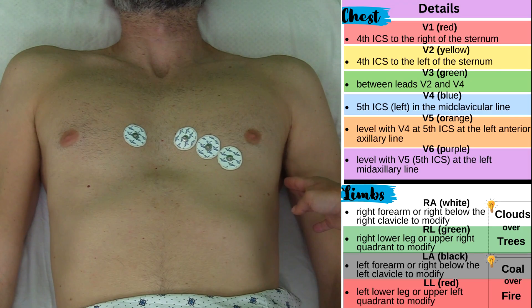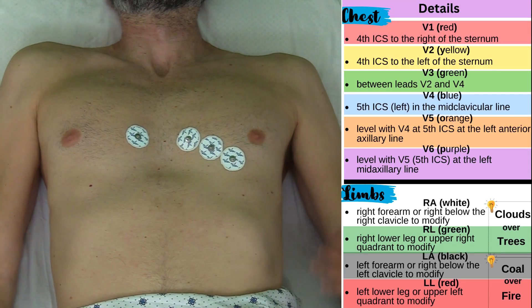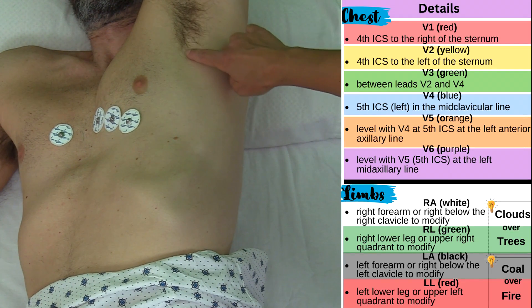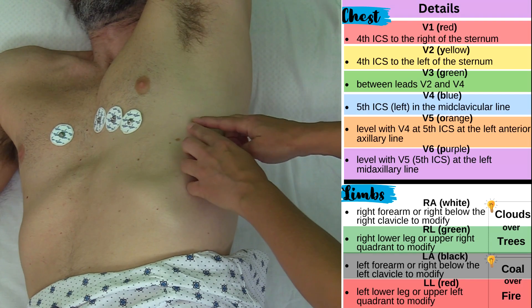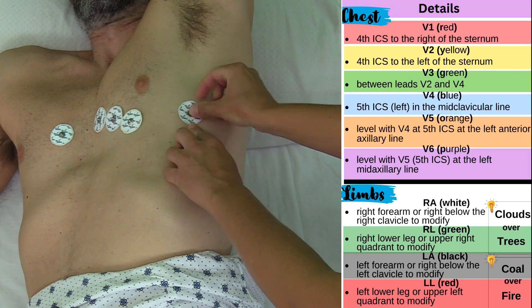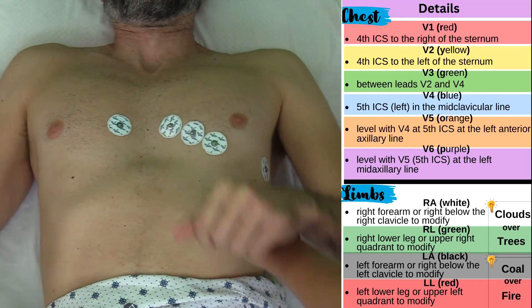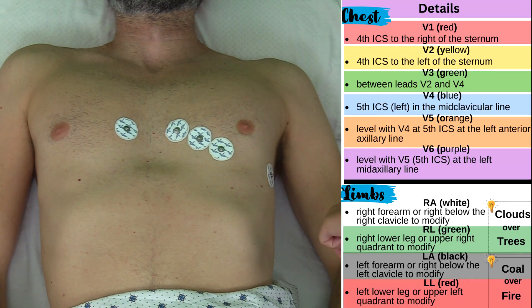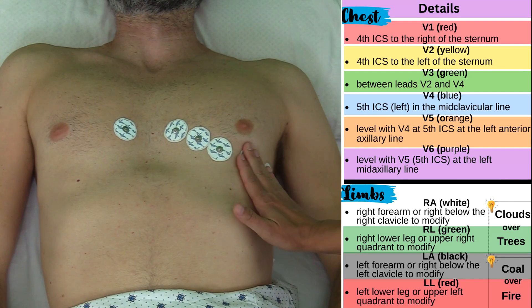Now I'm going to place V6, and I'm temporarily skipping V5 because V5 is going to go in between V4 and V6. V6 needs to be mid-axillary and level with V4. So I'm going to have you turn to your side just a little bit — mid-axillary means midway with the armpit. So about right here will be V6, level with V4. And now we're going to place V5, which goes in between V4 and V6, level with those, right here.